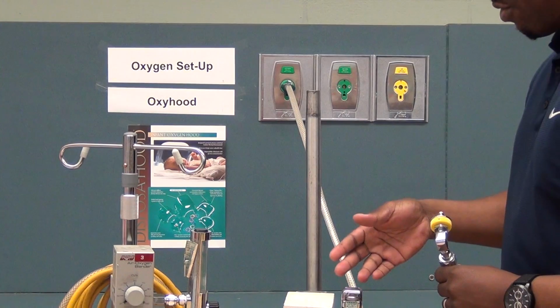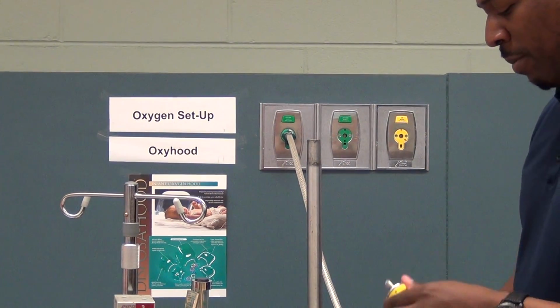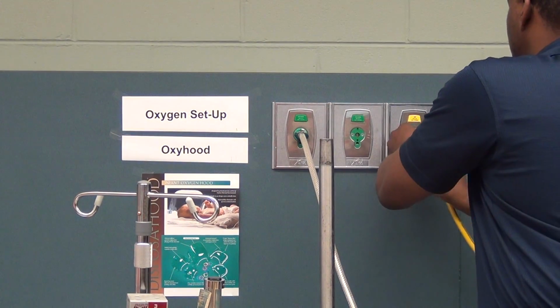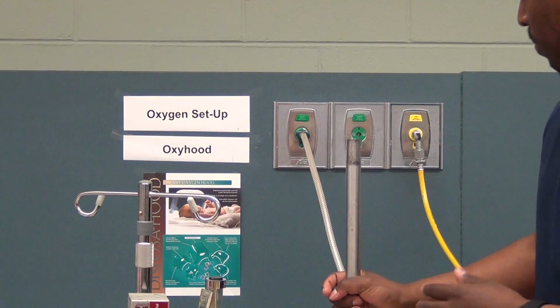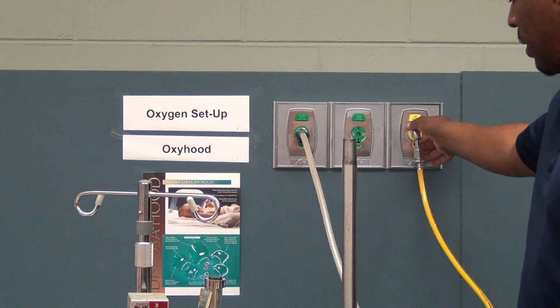And so if you hear this noise, that means that there's a disconnection or the tanks are empty. In order to turn this off, just plug in the other hose, like so. Once both gas sources are connected, then the blender stops its high-pitched alarm.